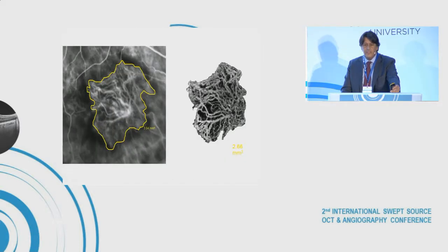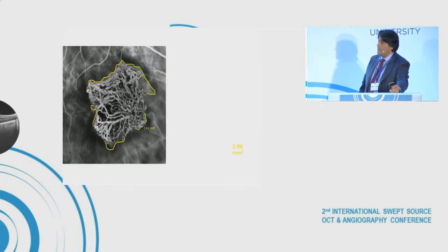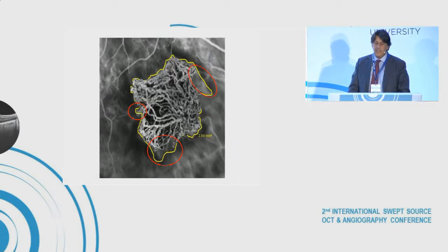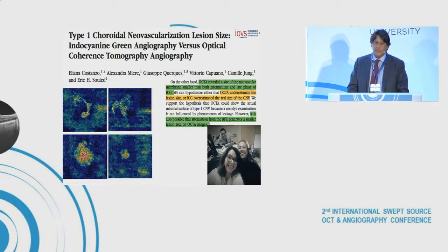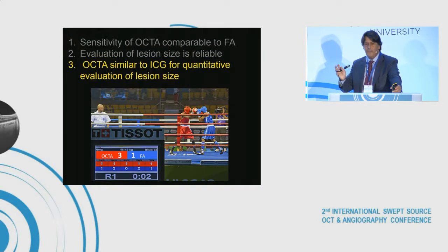There are sometimes some disagreements between both of them, but all in all, there is a very good correlation between the ICG and the OCT-A.